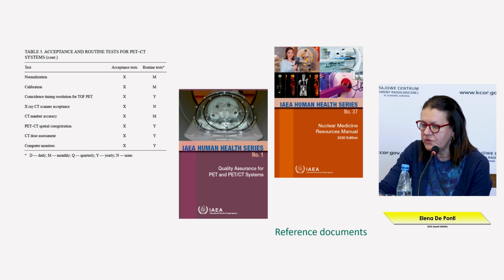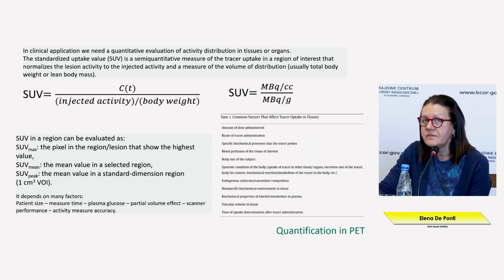According to how we use the scanner and our experience on the risk of variability of some of the tests, we can also change the frequency with which we perform each test in our center.